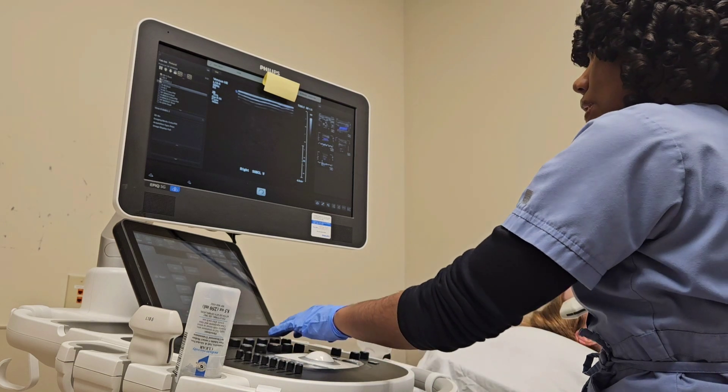If you notice, I did not perform compressions or attempt compressions on the subclavian vein — that's because it's located behind a bone. But I relied on secondary factors to determine the presence of a blood clot, such as color flow and pulse wave Doppler. If you are only able to obtain continuous flow or even no flow in that vessel, then you know there's an issue going on.